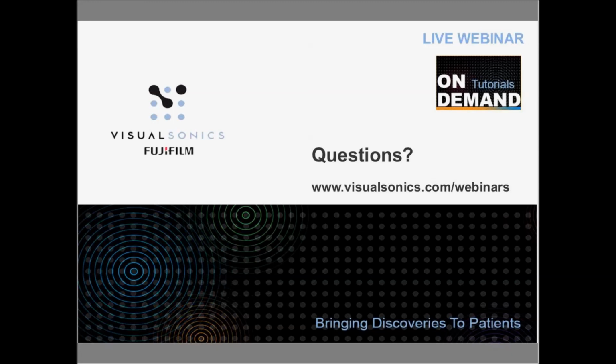Very good, Stephen. That obviously goes to the next question. What's the lowest frame rate that it can go, highest frame rate, and then how do you optimize the frame rate that you can acquire, that you can use strain with, right?